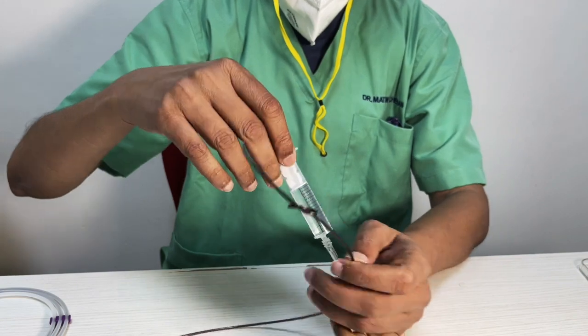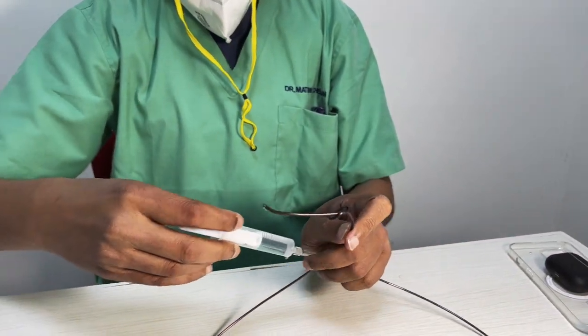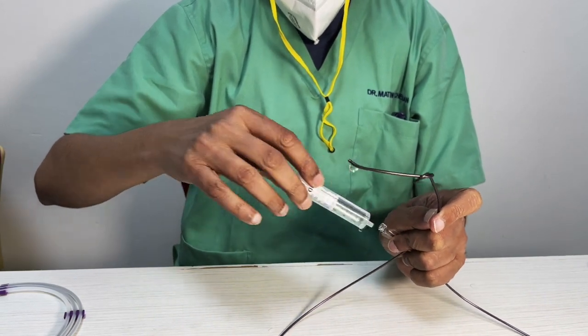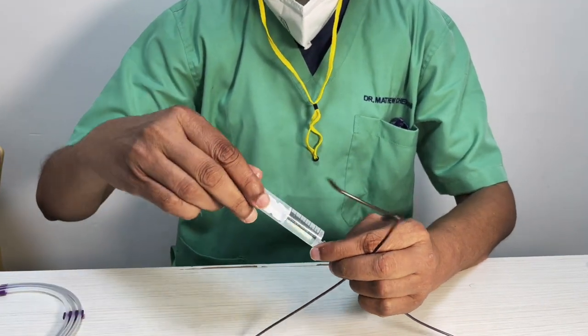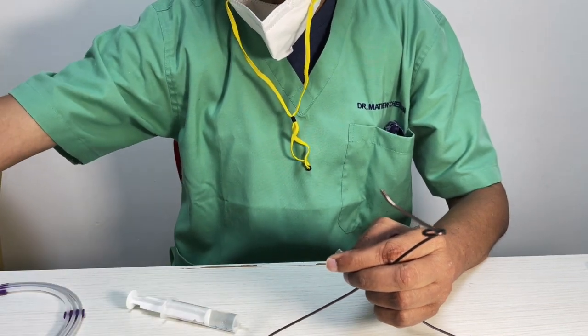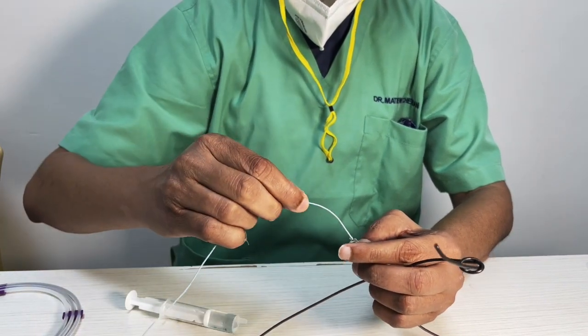Seriously, I'm not really paid by Medtronic to tell you this, but just want you to understand why certain devices work better in certain places. So here is this. We have wet the catheter. I hope the micro is also wet, otherwise it won't work. Let's just try to make you understand how this works.